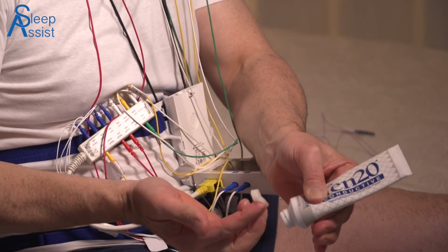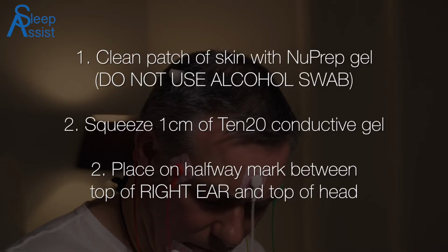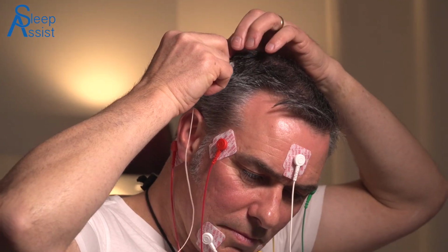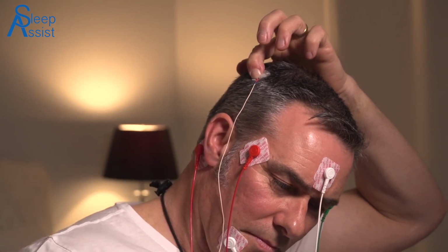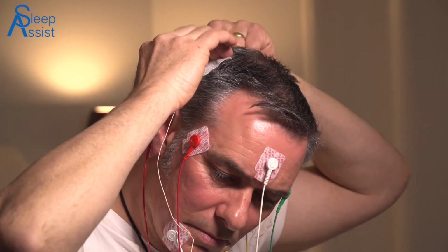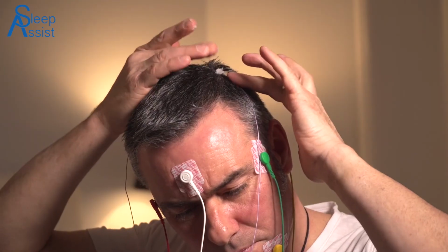Using a tube of 10-20 conductive gel, squeeze 1 centimetre of conductive gel out and place it on your prepared skin. Place the lead marked right scalp with the gold cup facing down onto the 10-20 gel and push down into the gel until it touches your scalp. Using a thin piece of gauze provided, place it on top of the gold cup and gel, pressing down firmly to secure. Repeat this process on the left side of your scalp.